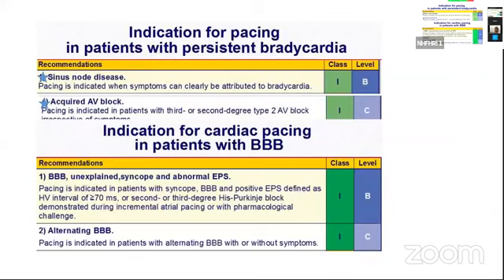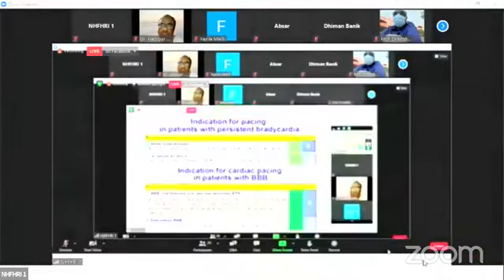So for the student, the thing that is more important is the indication of pacemaker and what are the sites of permanent pacemaker implantation. Usual site is the pectoral region. Initially we used to do it on the right side. Now frequently it is done on the left side of the patient, because the right side is the active arm, and because of the curvature from the left of the patient, it is easier to put the right atrial lead, and more curve gives more stability to the lead.